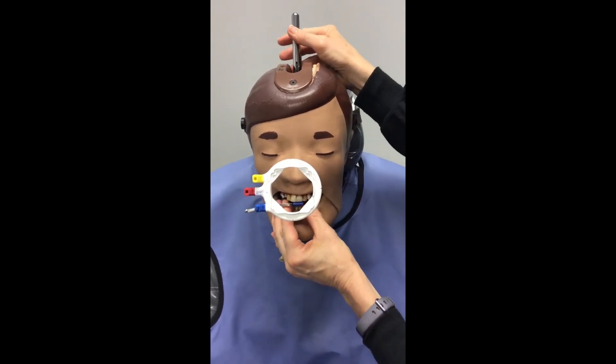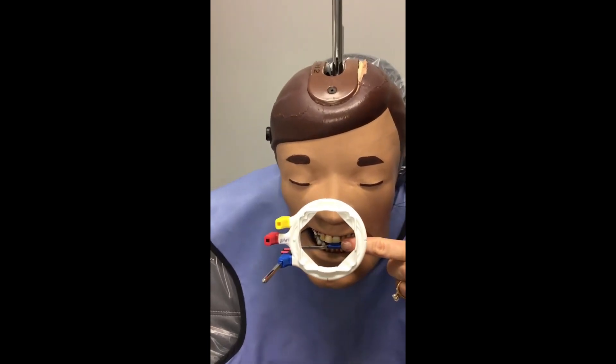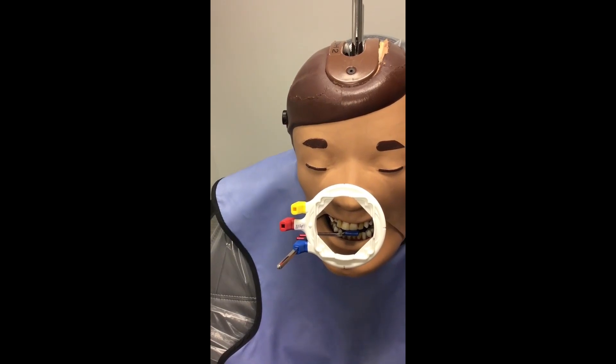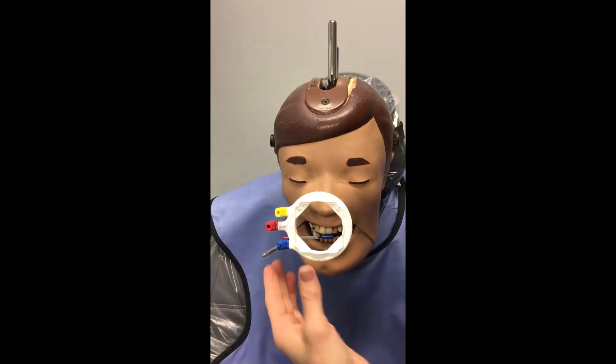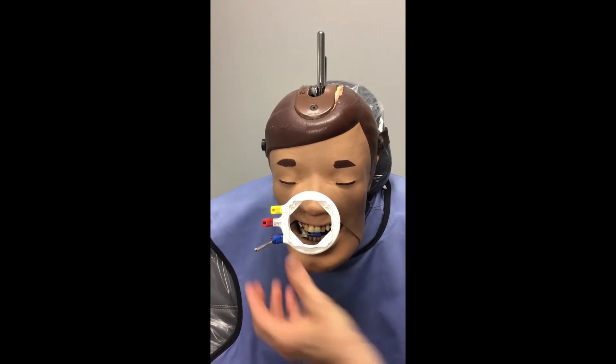You also want to have your patient bite as far out to the end of the bite block as they can. This allows your teeth and your sensor to be parallel to each other, which is what we want when using the paralleling technique. The next thing you're going to do is take your ring and slide it closer to the patient's face.